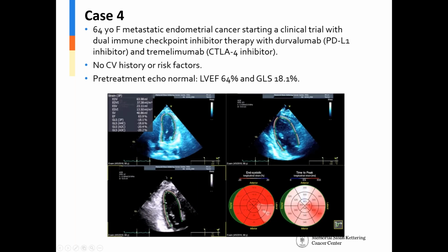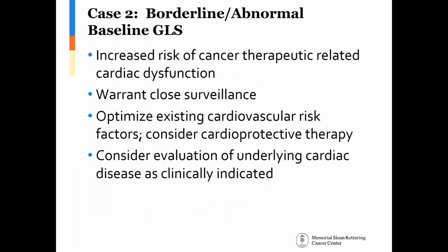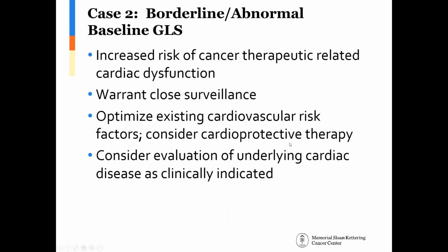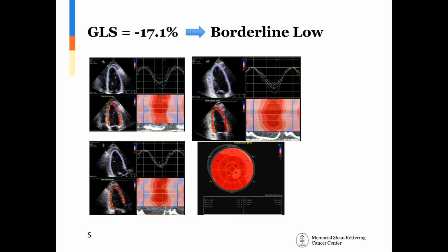So you show these beautiful bullseye plots of global longitudinal strain, and they certainly look convincing on these images. But if I was to take a basic survey of all the patients that I'm evaluating in which I get an echo at WashU, the chance of seeing an image like that out of 100 patients, I would say it'd be under 10, to where you have such a nice profile and a bullseye plot and everything else.